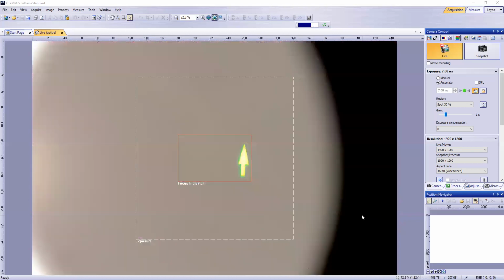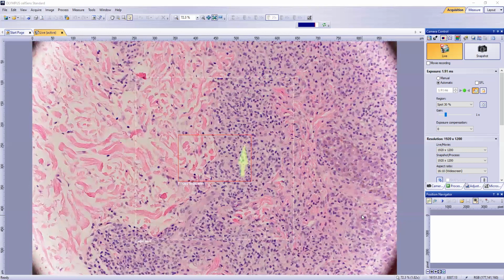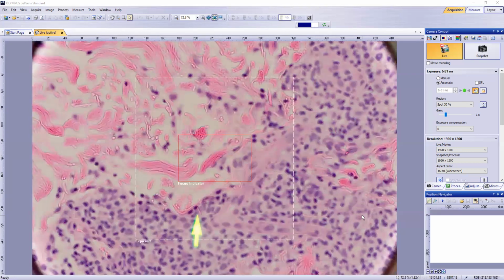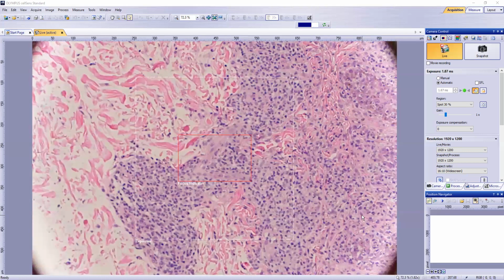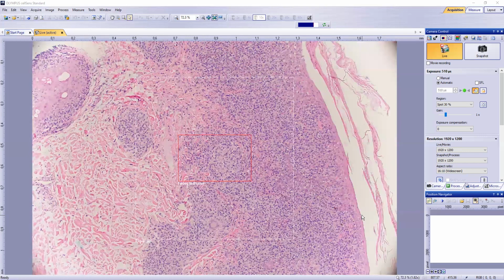Another feature that you'll appreciate with syphilis is that the blood vessels are kind of slammed shut, so you don't really appreciate them as blood vessels. And that's because there's significant endothelial cell swelling to the point where the vessels are just slit-shaped structures, and you don't really see the vascular lumina, but you will see these plump endothelial cells that are swollen and surrounded by the mixed infiltrate. So those are the key features of syphilis that allow you to distinguish it from lichen planus in this case.